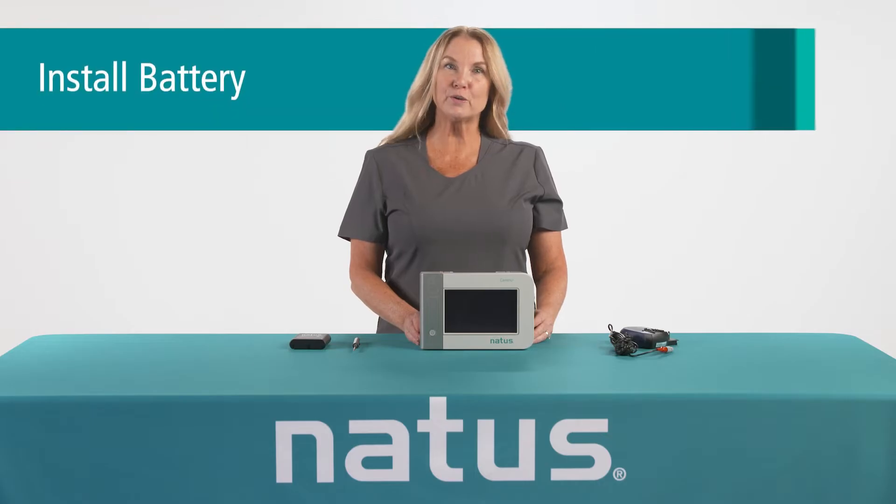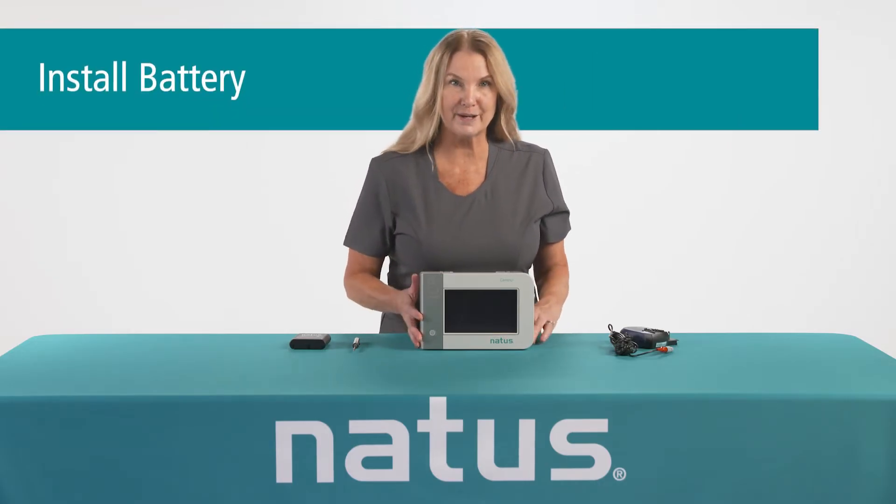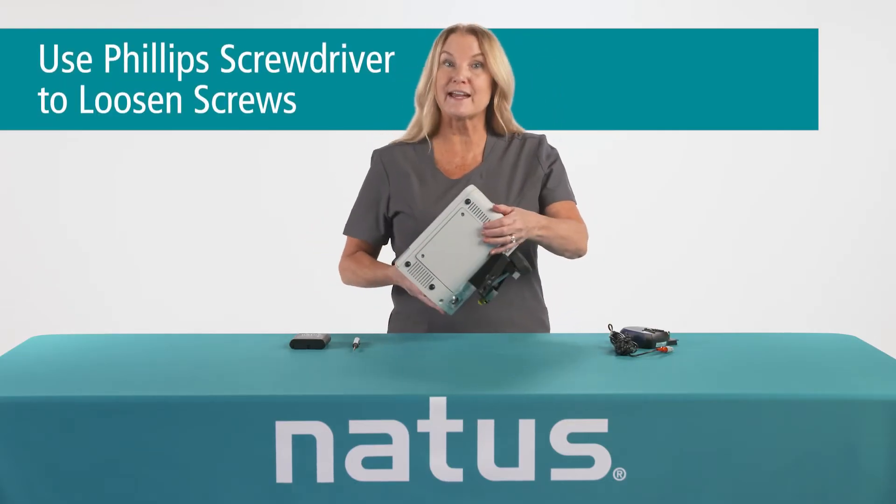To set up the Camino monitor, you'll want to install the battery first. To do this, you'll turn the unit upside down and use a Phillips screwdriver to remove the screws and cover.